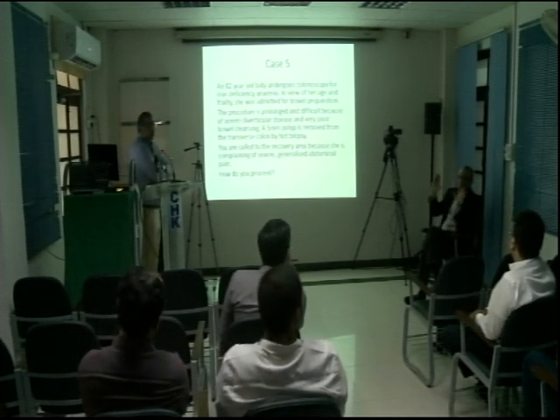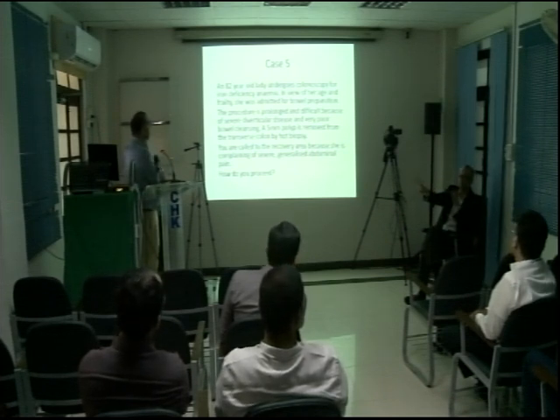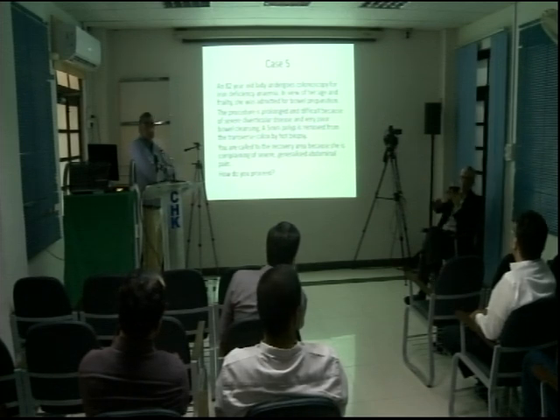But if you had a bad bowel prep with severe diverticular disease, you wouldn't know where the hole is. So bad bowel prep here is the number one enemy. Number two.